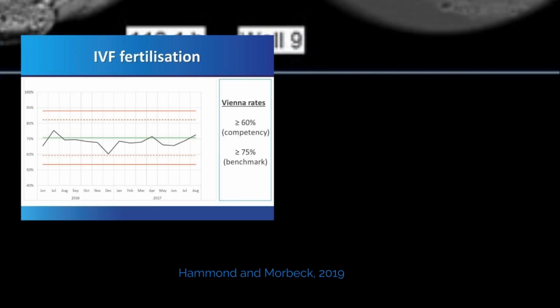Obviously, if a patient only has 1 or 2 embryos or 1 or 2 eggs, and you're not planning to go to a blastocyst, then that's not included in that calculation. And so those are left out. It's mostly small egg cycles that are left out of this. So it's a different group of patients. But you can see we bounce along nicely there.